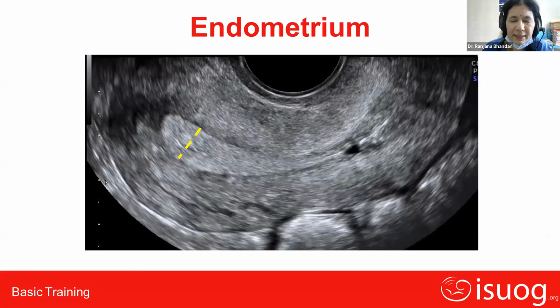So now my second topic is endometrium. Endometrium is a very dynamic structure. See, you are seeing the whole uterus. This is the cervix. This is a Nabothian follicle over here. And from here, the bottleneck appearance of the endometrium: this way is the cervical canal and this way is the endometrium. See, you are seeing the endometrium in such a nice manner. This whole is the endometrium. And at present, we will study only this endometrial structure.